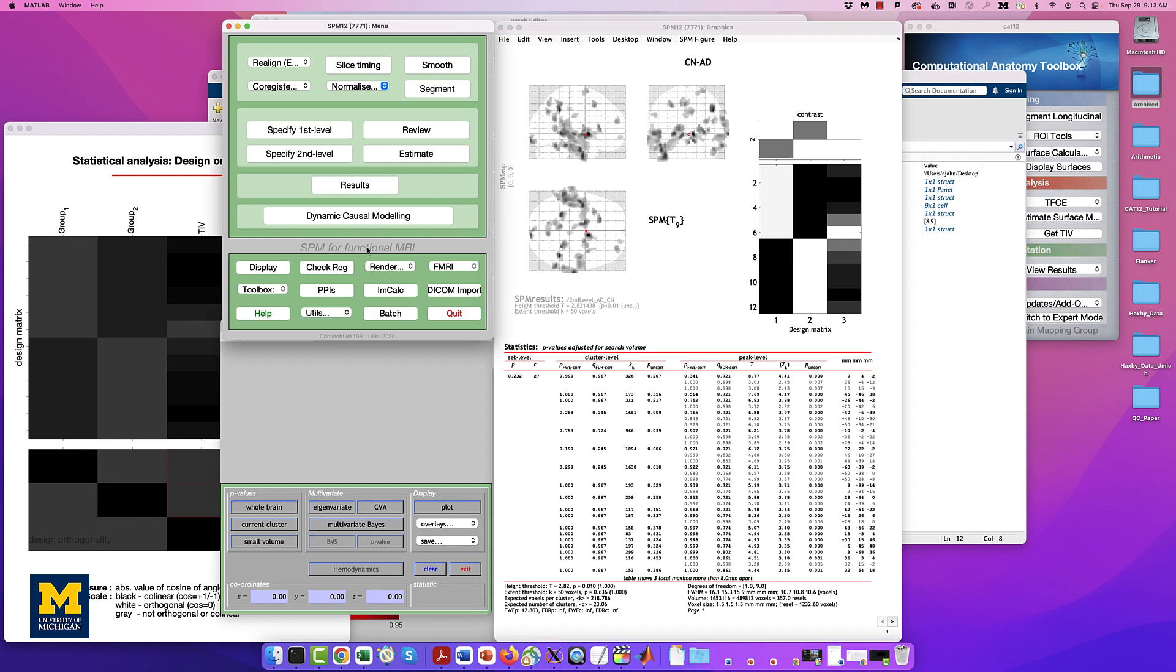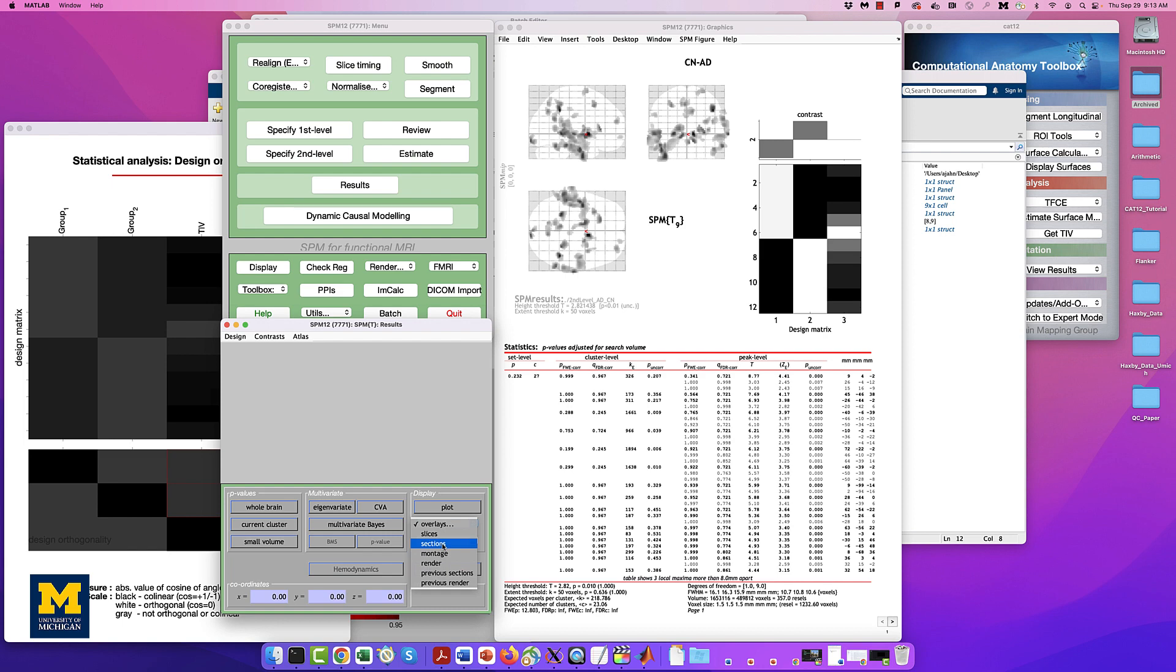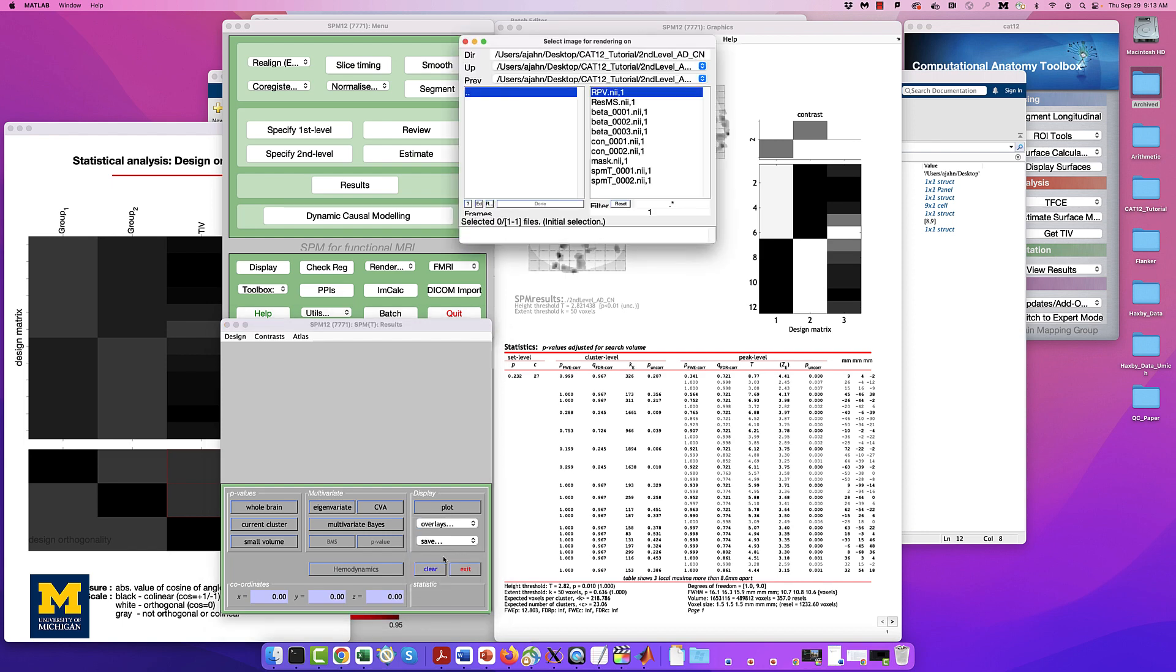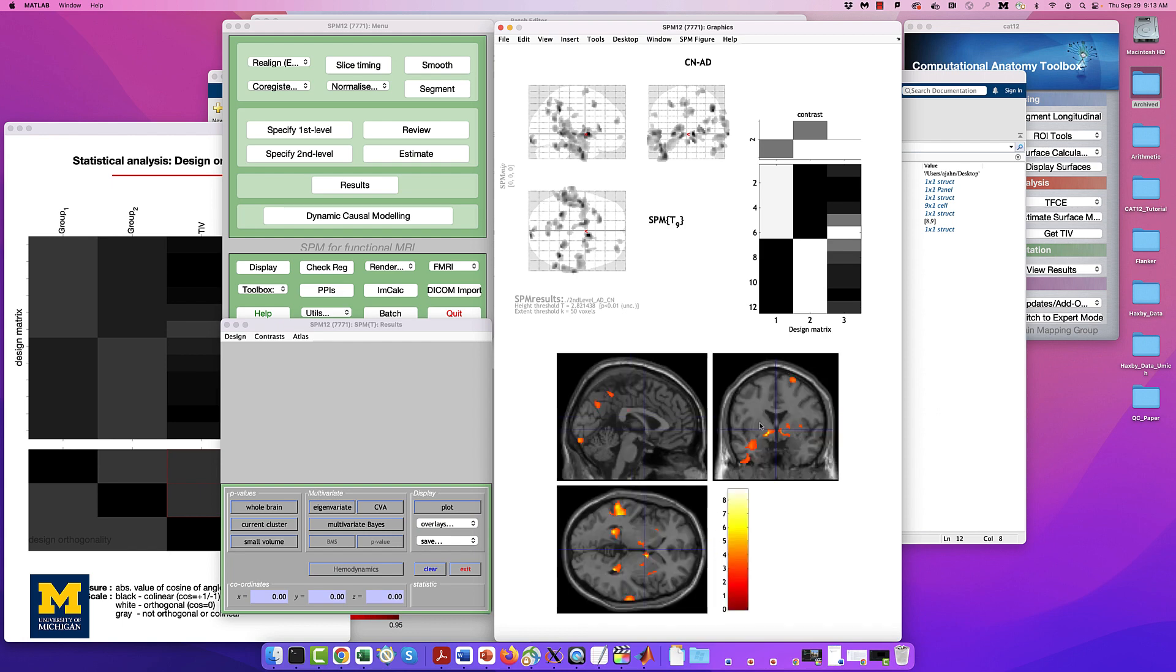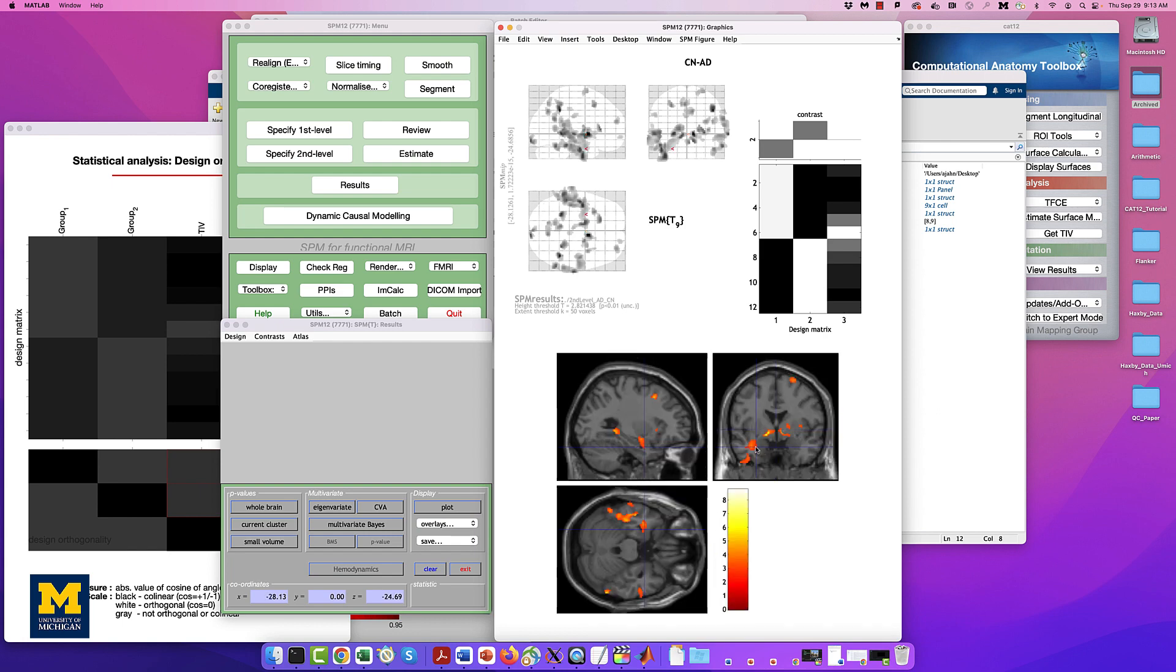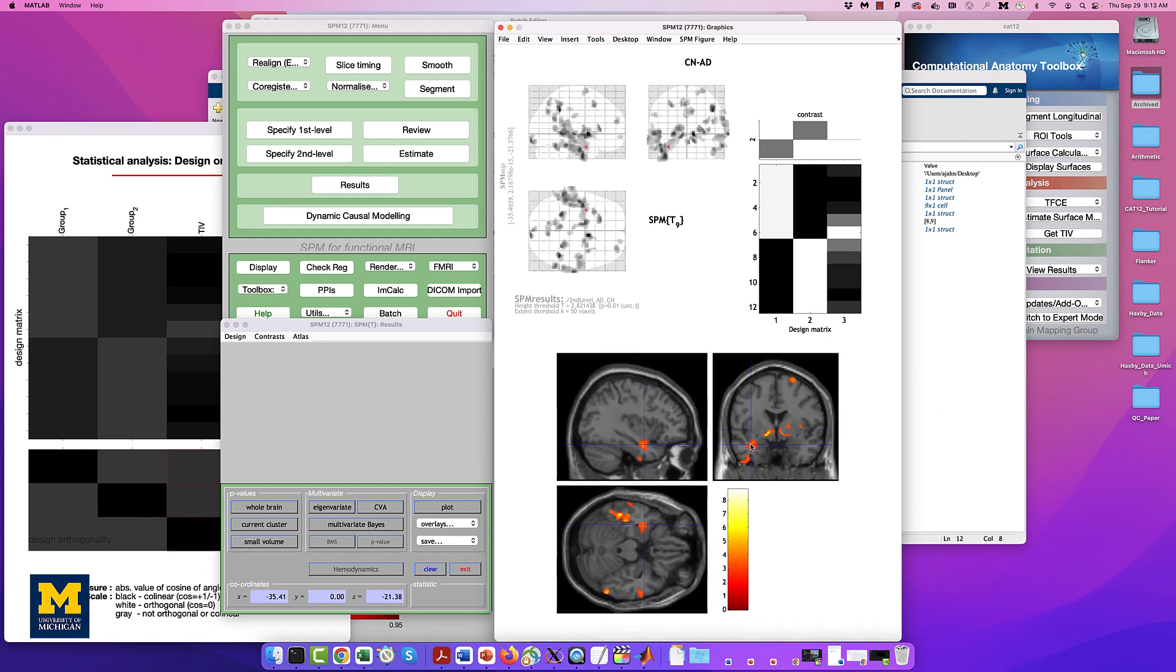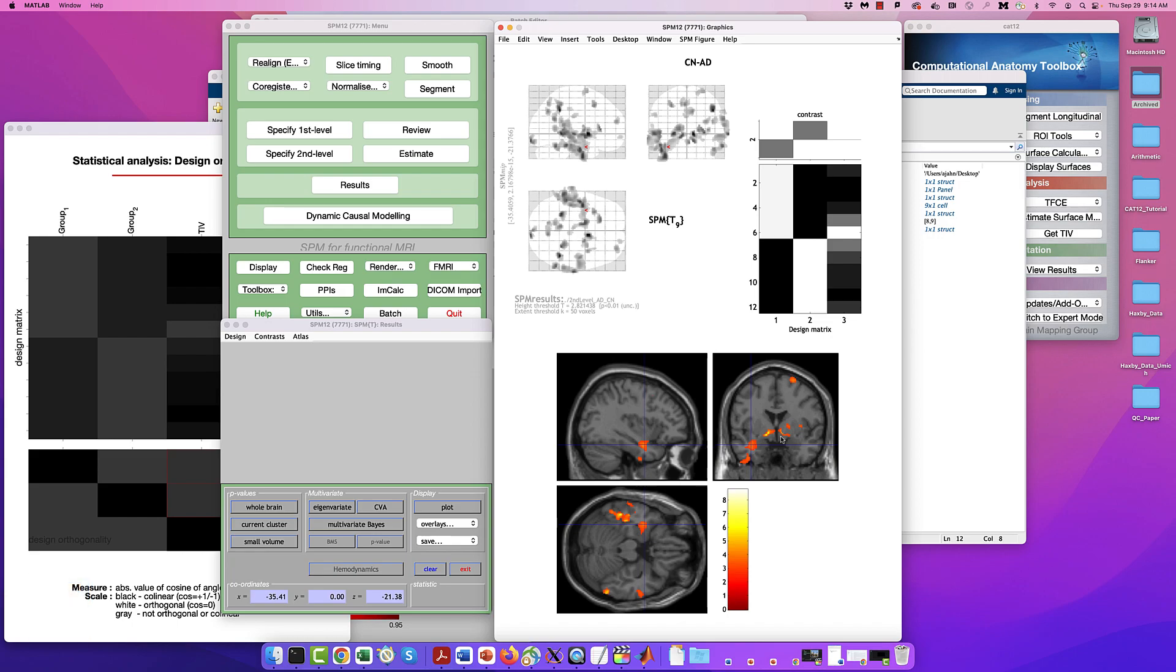However, we still see some results that may indicate trends. Click on the Overlays drop-down menu in the Display window, and then click Sections. Navigate to your SPM12 canonical directory, which for me is in my home directory, and then select a template such as singlesubjectt1.nii and click Done. Use the crosshairs in the Viewing pane to click and scroll around the image, looking at where there is significantly larger gray matter volume for the CN group compared to the AD group.